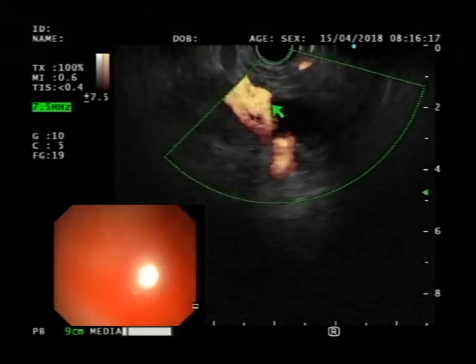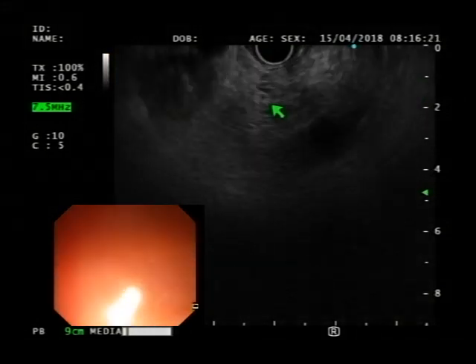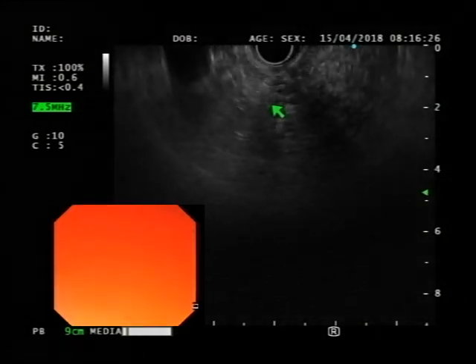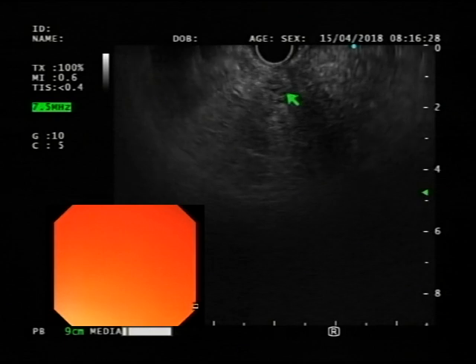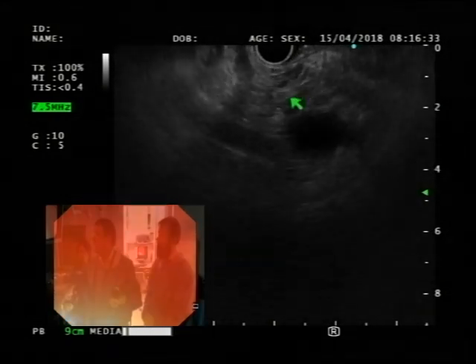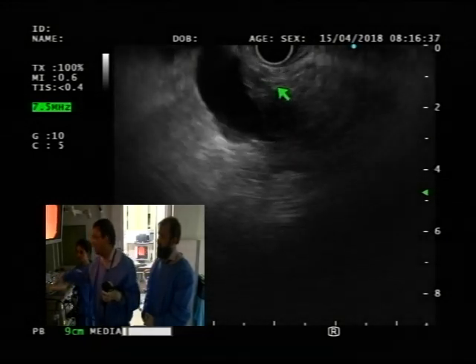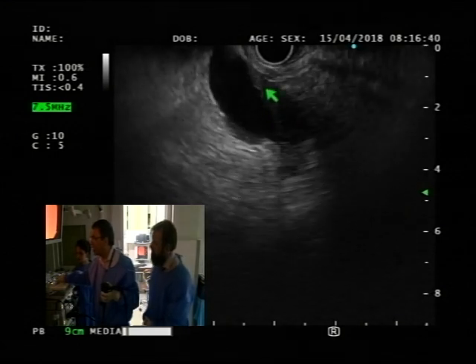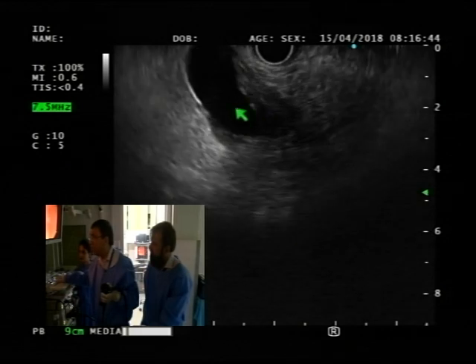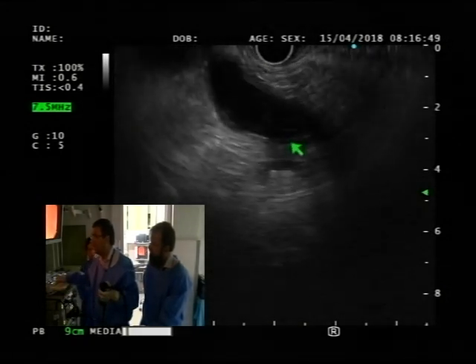And I don't know if they are seeing this clot as a mass in the head of the pancreas, because I don't see any mass in there. Right. And the other thing is, if you look at the bile duct, that's not dilated. You expect the bile duct to be dilated, but you don't really see that. So here we do see this clot inside the portal vein. There is a flow. You don't even need to put a Doppler on that, and you see a blood flow in that. You have the eddy currents there.